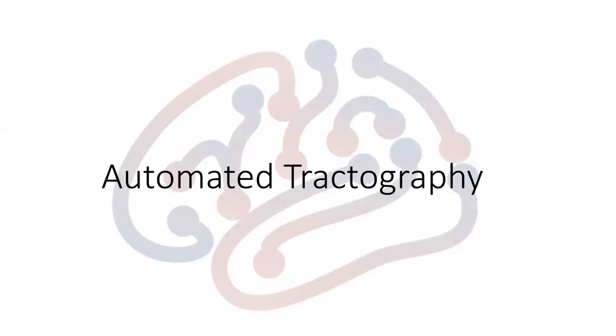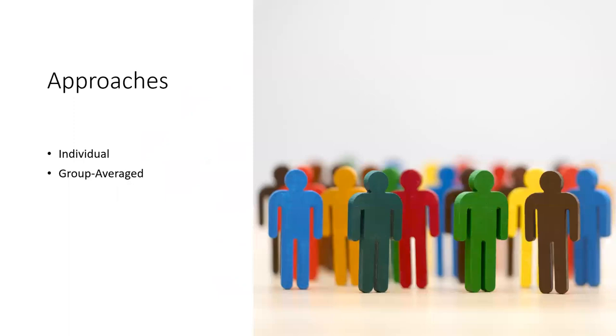Hi! In this video, I'm going to demonstrate automatic tractography. We could do this in two ways. One is individual mapping. Another one is group average mapping.